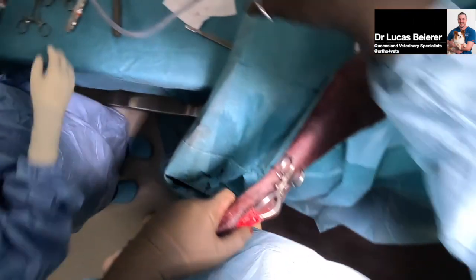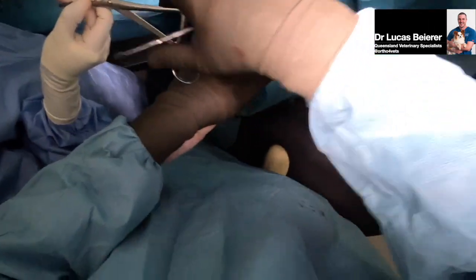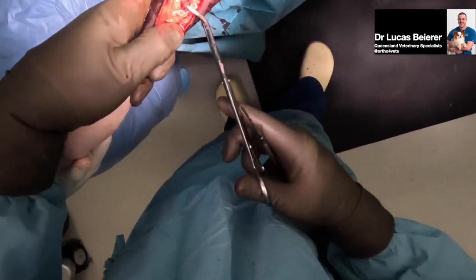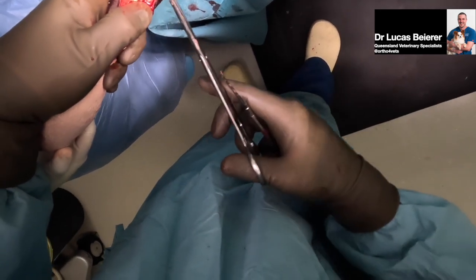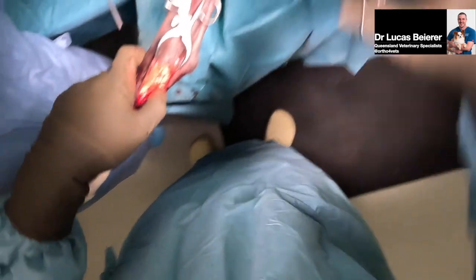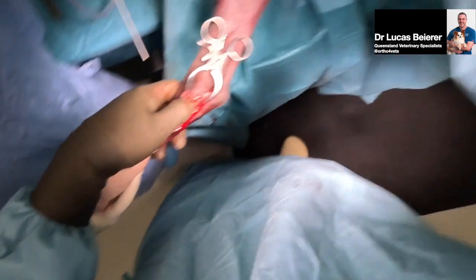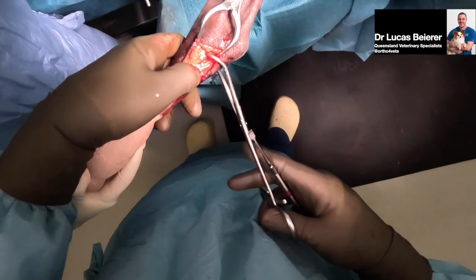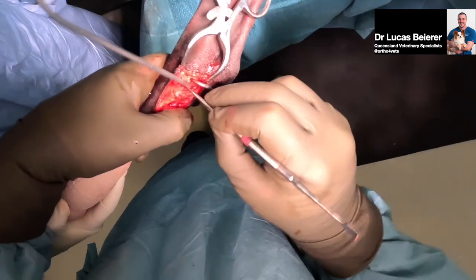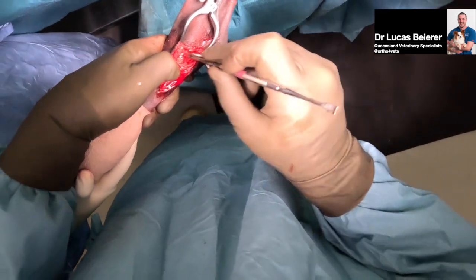The other ones, the other shaped ones. Sorry, the big ones, but the sort of more encompassing ones. Can you see it? I think it just goes there. I think because we've reduced the central tarsal, there's not much left. I think we'll just put a positional screw in that. Just a small, let's just go a 2.